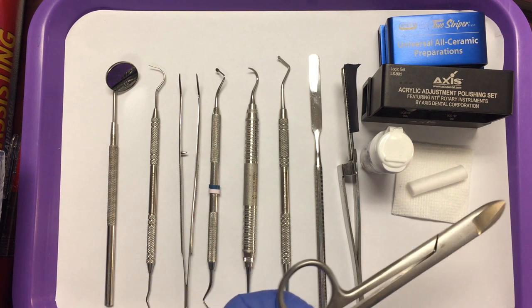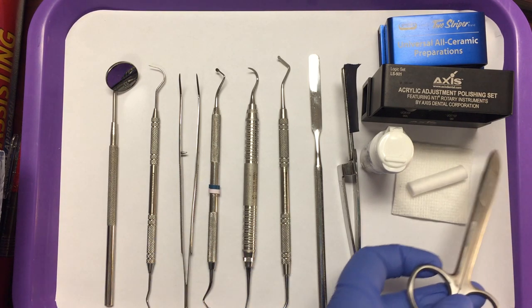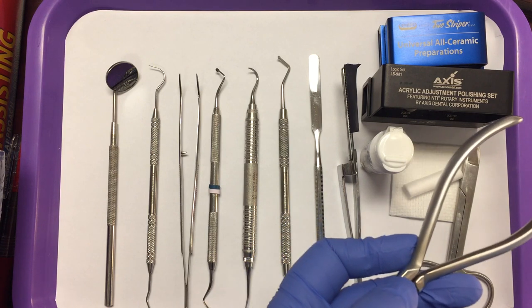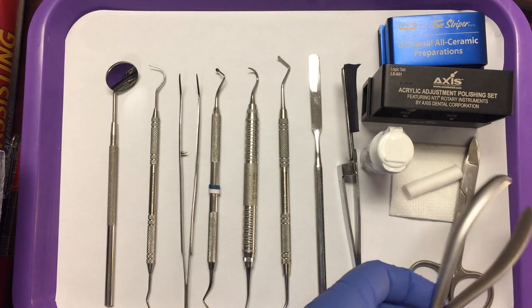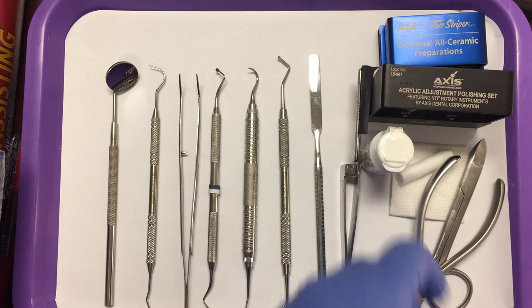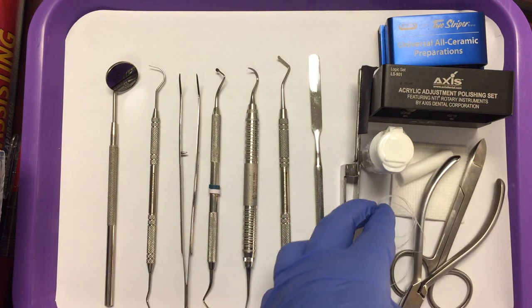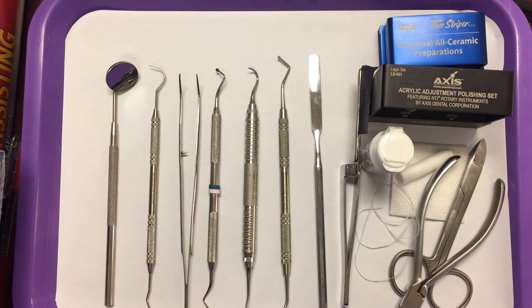We add our crown and bridge scissors because when we make the temporary we'll need to trim it. And the other thing that we need when we make our temporary crown is our contouring pliers. We will also add our floss. The floss will check the contact areas, and on a prep tray they check the contact areas for the provisional or the temporary restoration.